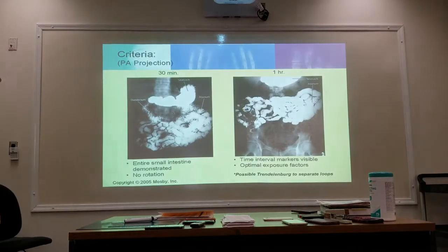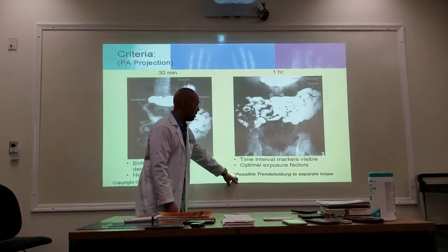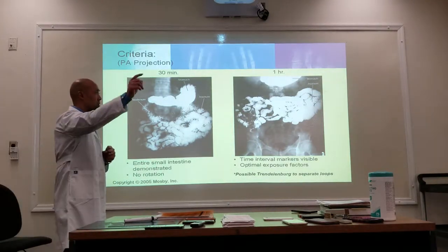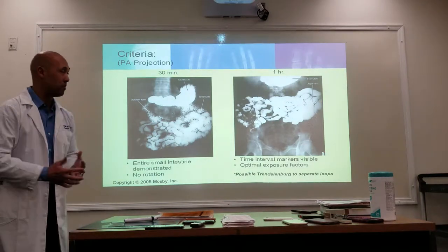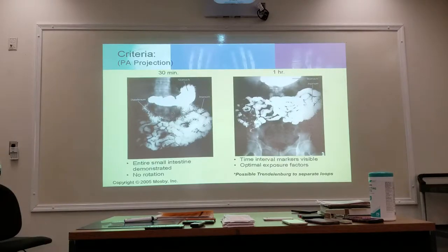All right, PA projections, 30 minutes, 1 hour. So the entire small intestine should be demonstrated, with time interval markers, okay. Possible Trendelenburg. In some cases, you may have to take the shots in Trendelenburg to separate the loops. Again, that's going back to the case where a patient is in an AP projection, supine position, sometimes you may have to tilt the table to open up the loops to get a better visualization of the bowels.